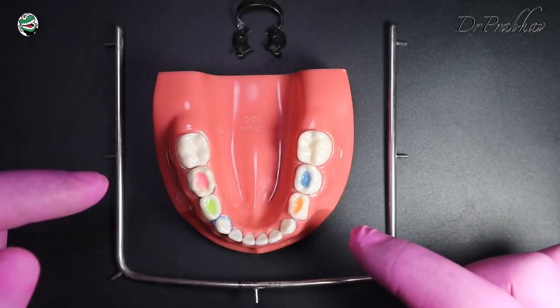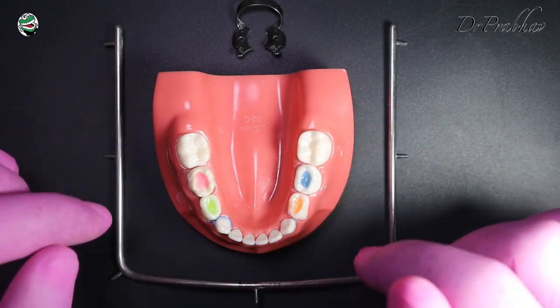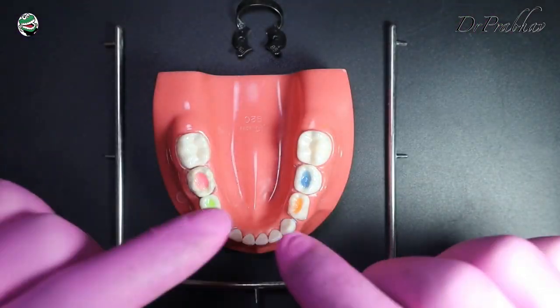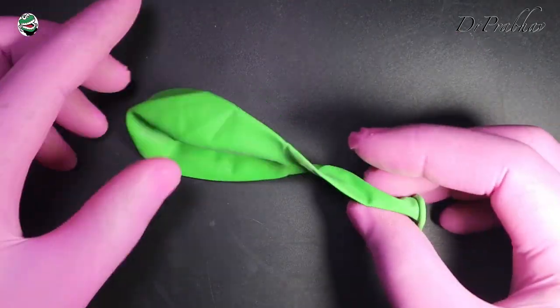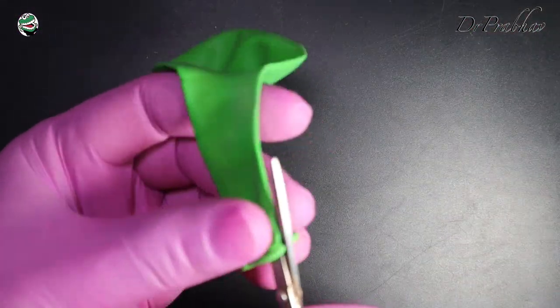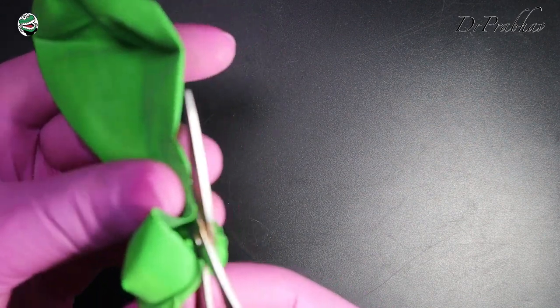So we are going to learn in a step-by-step way on tooth 85. So for that we require the rubber dam frame, small, for the pediatric patient. Then this is the rubber dam clamp. So we'll use it and learn step-by-step. First thing is that we'll take the balloon and cut it from the edge, as you can see over here. We'll take this edge and follow this edge like this in a proper way up to the top of the balloon.